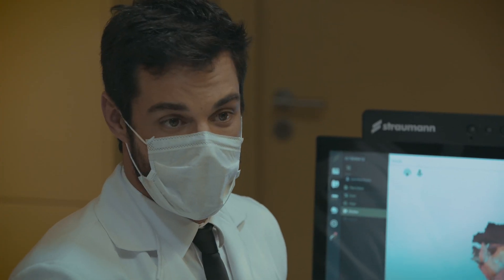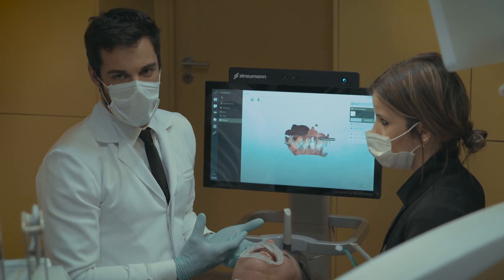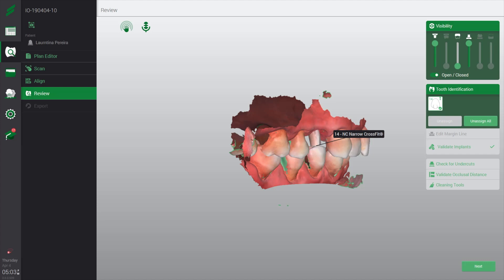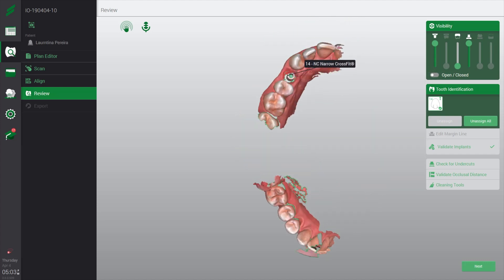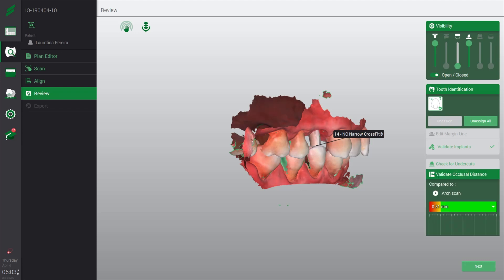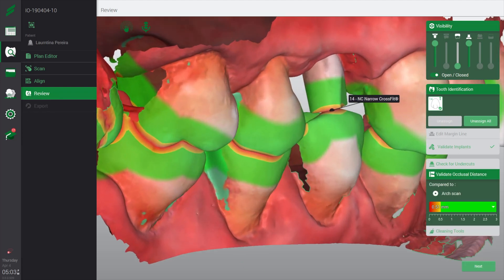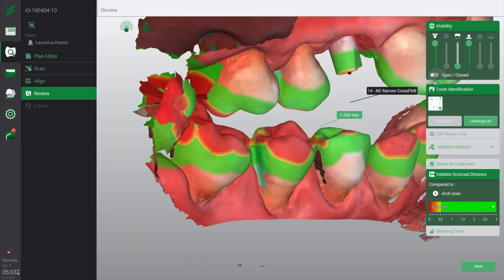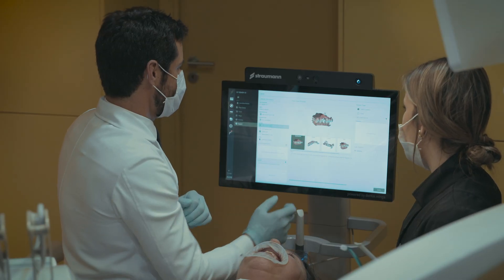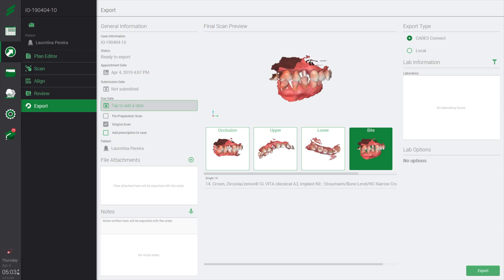Now we have our final scan and we want to check if we have enough space for the final crown. You can see the visibility — open and close your bite. We want to validate the occlusal distance. In this case, we can see that we have enough space. You can open and see the contact points on occlusal surfaces. You can check your impression and verify that everything is OK.